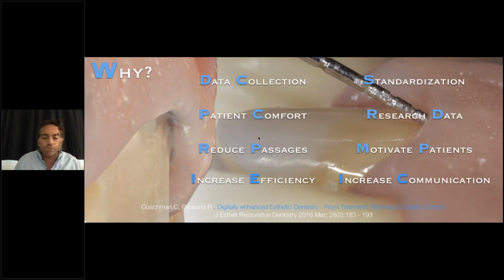And all of these aspects are just aimed to increase efficiency, to increase the communication, to motivate the patient, to explain to the patient what is better. But also, if you want to do more research, we have digital calipers which are helping us in being more predictable, and in standardizing our way of doing research, not only our clinical routine.